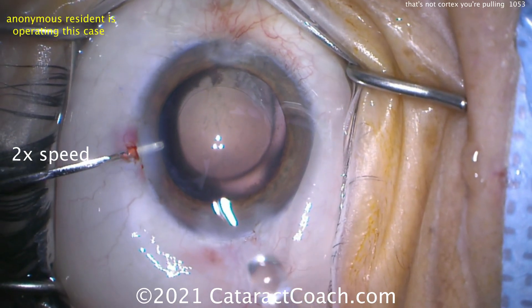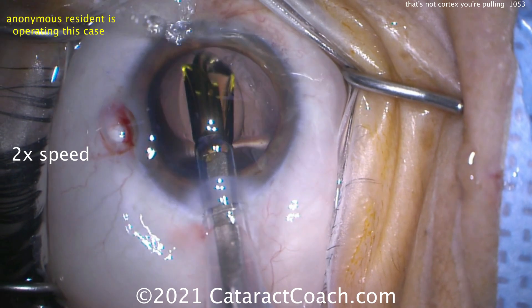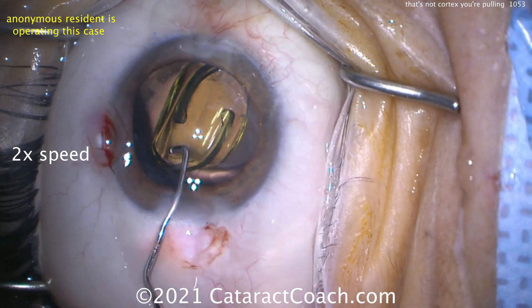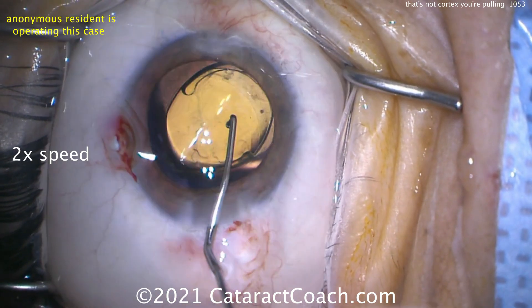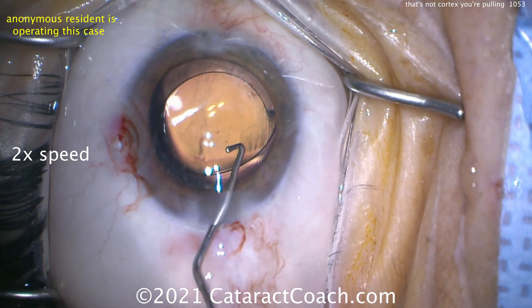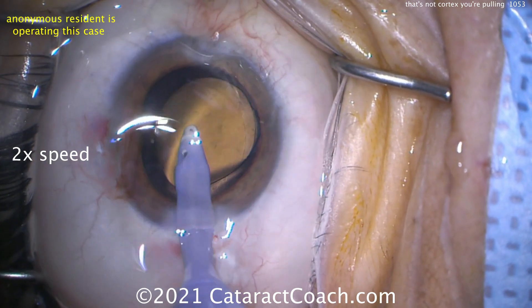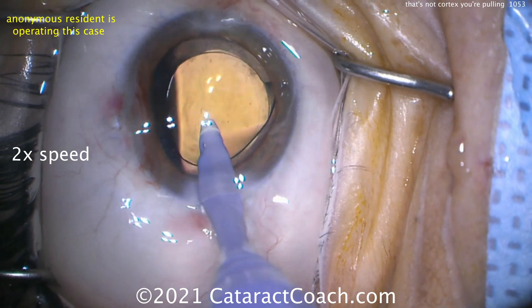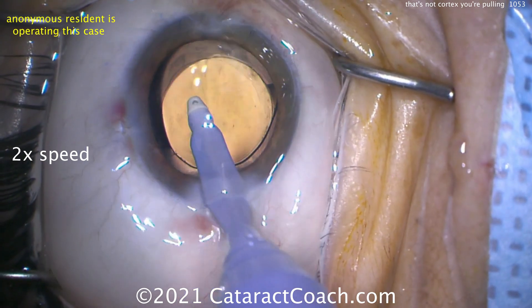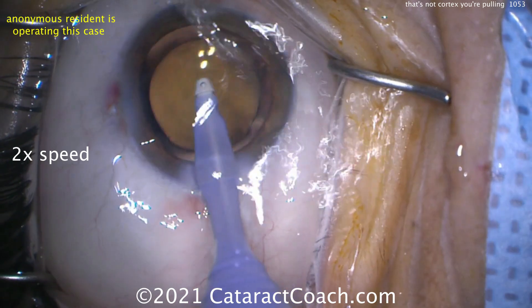Coming out of the eye is not ideal here, but the bag has been filled with viscoelastic. Here comes the IOL going inside the capsular bag — single-piece acrylic. You obviously cannot put a single-piece acrylic lens in the sulcus. Now, slight rotation of the lens so that one haptic bolsters the area of weak zonular loss. That looks great, and a minimal amount of manipulation was done. You don't want to lose viscoelastic, then struggle to get the haptic in and re-rotate — all that just makes it higher risk for more damage. Once a little damage is done, let's live with that and not have more damage.